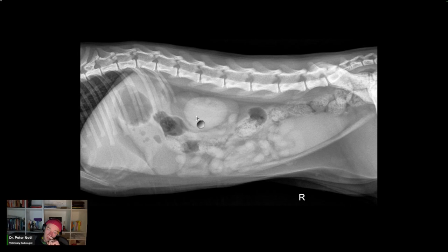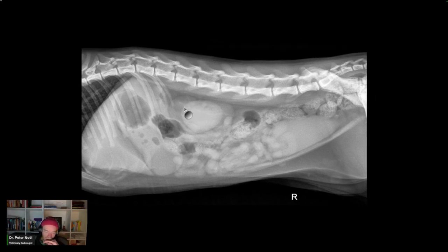I'm not that concerned about these. I don't know. This one seems to go cranial. I think I can follow it all the way here, and it's even cranial to the hilum, which is in the middle of that organ. If you're talking the hilum of the right kidney, it's probably right here. This thing's cranial. I don't know. I don't buy it.